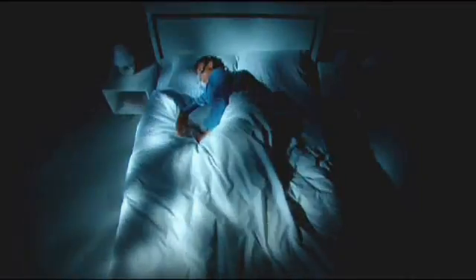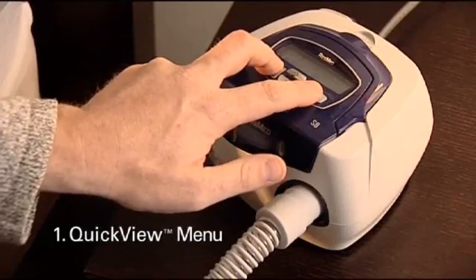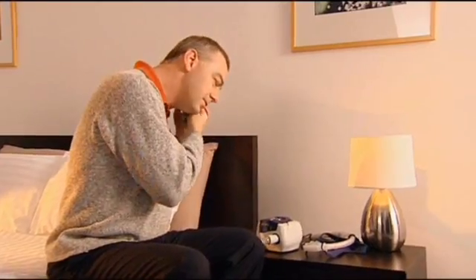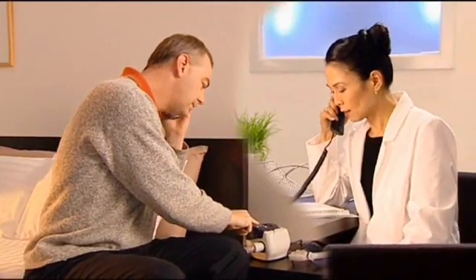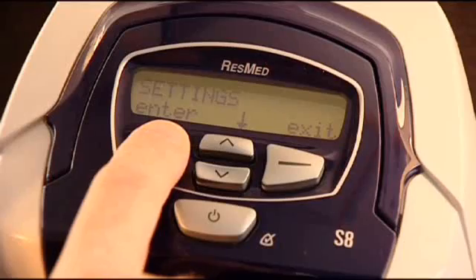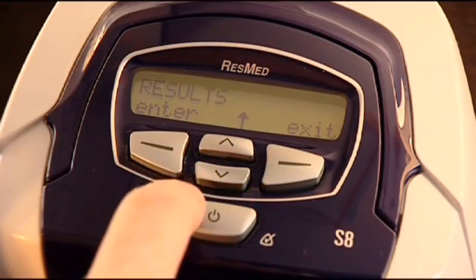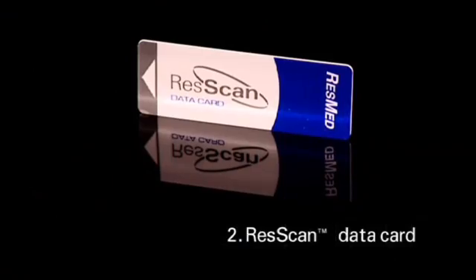As your patient sleeps, the data is stored on board the S8 and available in three easy ways. Firstly, data can be accessed at the touch of two keys by using the quick view menu, so whether in the clinician's office or guiding the patient over the phone, device settings and efficacy and usage data are easily accessible.